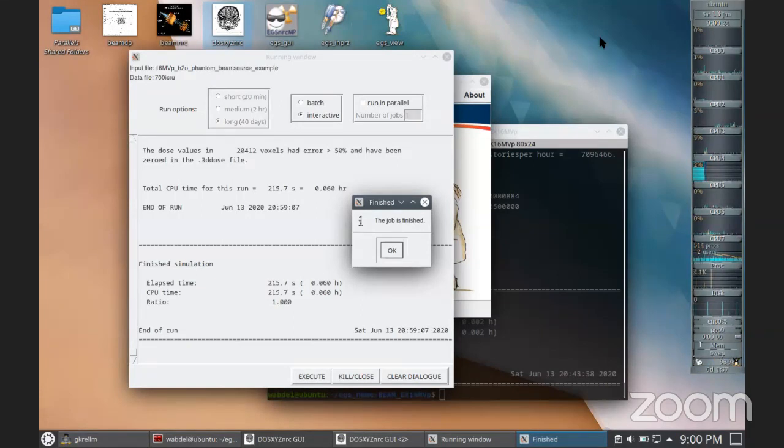called fake beam, okay? So it's just a model. And what they were interested in is actually the triple F beams, because that was really the important thing. So basically they used a 21EX, this was understood from their paper. And then they tried, okay, let's change a little bit. Let's guess how the flattening filter for a triple F beam should look, like a slab or something like this. It's not like a cone shape. And they made it, and they varied this with different thicknesses, different materials, until they got a match with their PDDs. So maybe that also is something a group is interested in. We can do that.